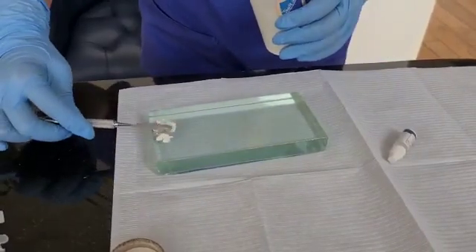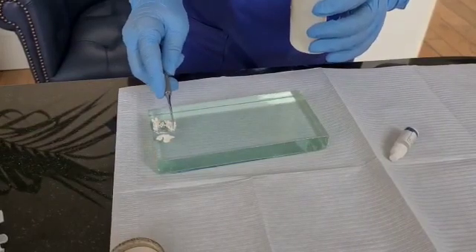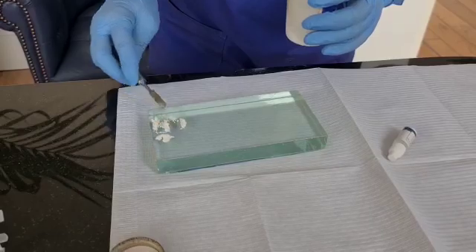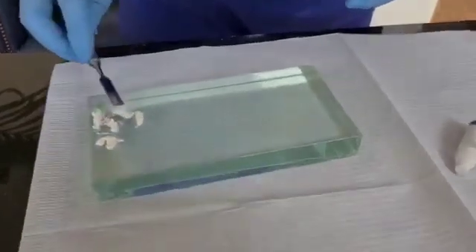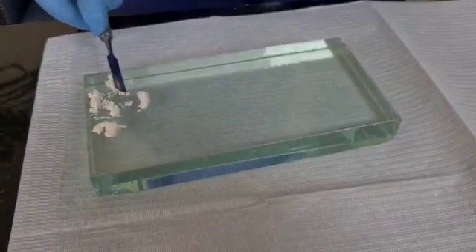I always take quite a lot of powder on my slab so that I don't have to open the bottle again. But when I'm handling this or when I'm mixing, I always make sure that my gloves are clean, so even though I toss in, they are not infected or contaminated.